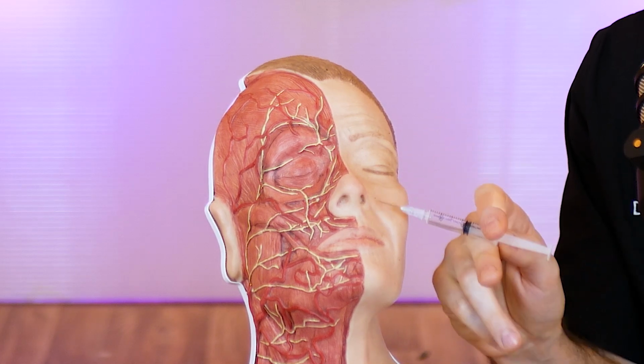to the novice injector. Whereas for me, that injection looks really dangerous because it's angled up towards what I know is underneath here, the infraorbital artery. And it's a little bit closer to where the facial artery becomes the angular artery. So there are 2 big risk factors for that angle that are different to that angle. And that only comes from, before each injection, getting the anatomy straight in your head and knowing the main things you don't want to hit.